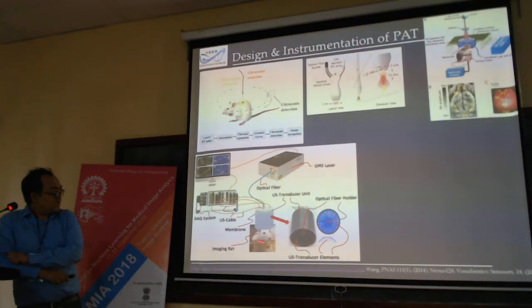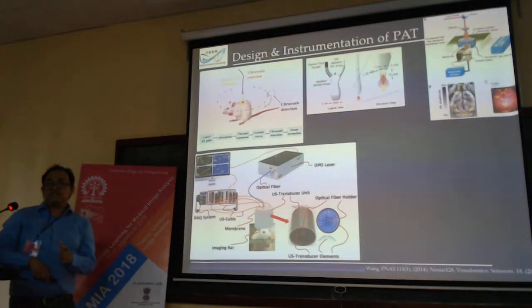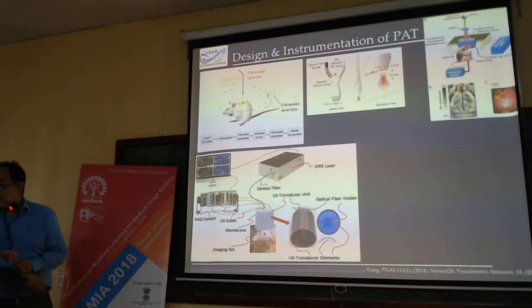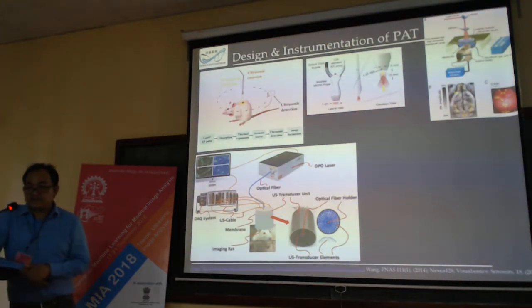Now, other than this one, people already started thinking of whether we can adopt this kind of imaging system with our conventional ultrasound imaging system, because detection is sharp, only the illumination matters.